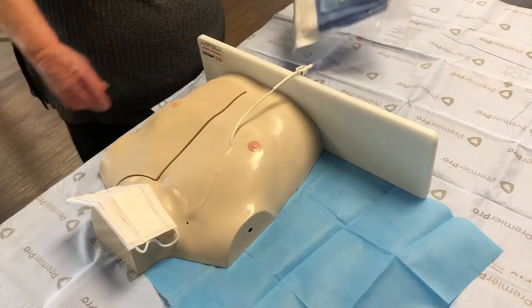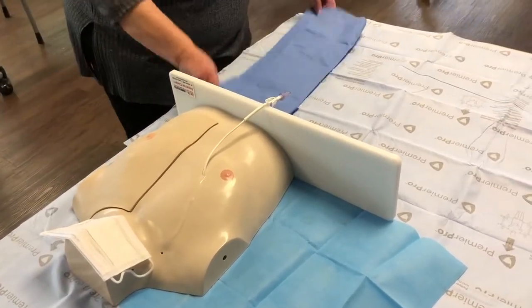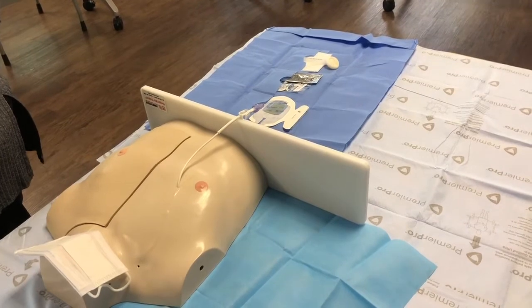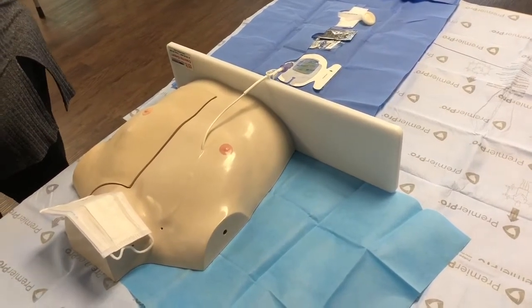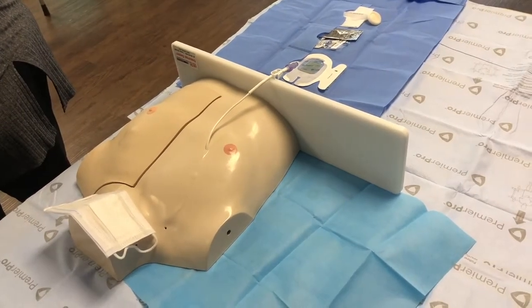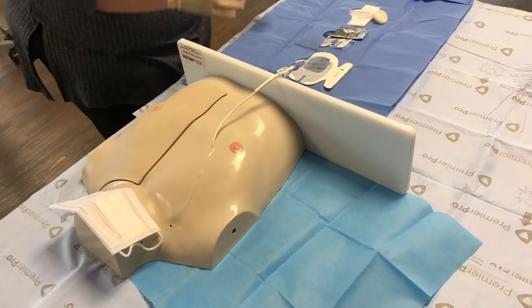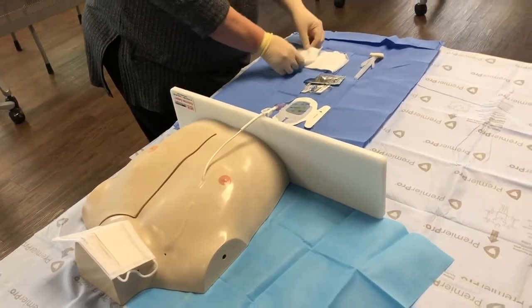Open the blue packet of the dressing kit labeled 2, Applications, being sure to only touch the 1-inch border of the blue sterile drape. Maintain sterility at all times during this procedure. Don sterile gloves. Separate the 4x4s and open the stat lock package if you're going to use the stat lock.